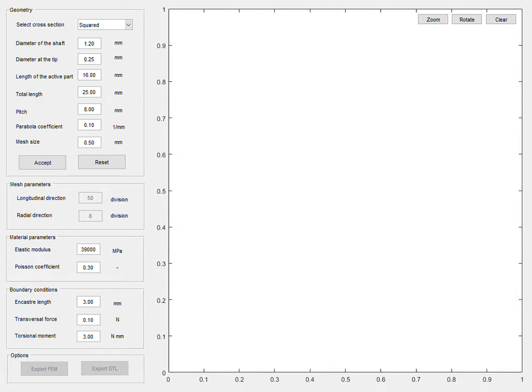Hello, this is a short video to demonstrate the capabilities of the tool that we are developing to generate the geometry of rotary endodontic files and perform a finite element strength analysis of the generated geometry. In this part, we have the definition of the geometry.